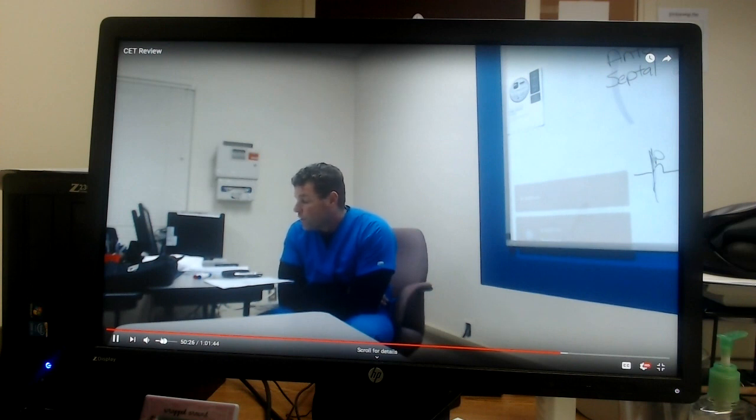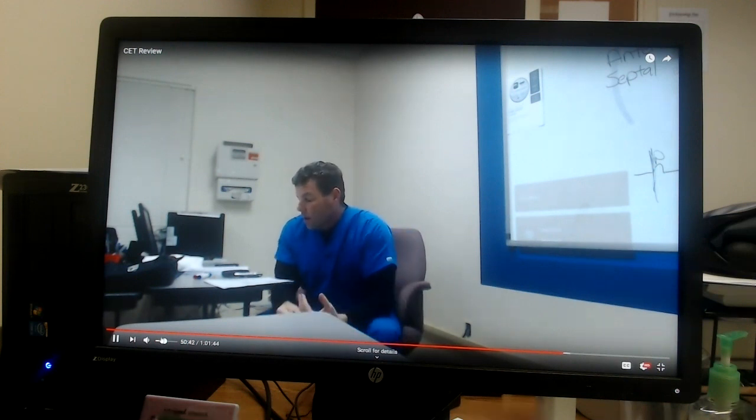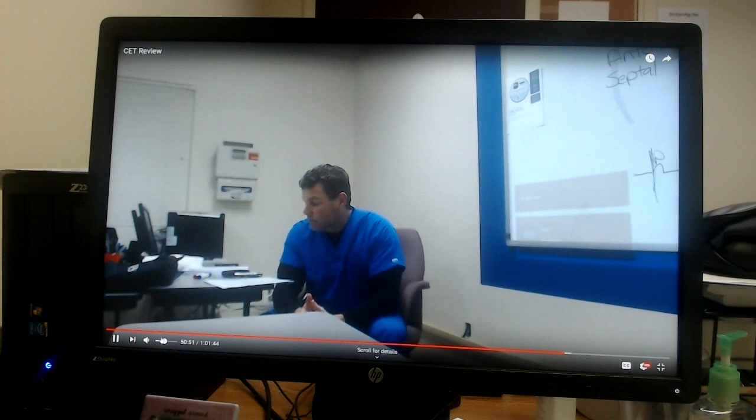97, the technician is verifying the calibration of the EKG machine. The technician knows that the standard calibration mark should be which of the following amplitudes? Number 5, 10, right, 10 small blocks or boxes. After performing a non-standard EKG on a patient, the gain setting should be returned to which of the following as the standard? B, right, 10 millimeters is the same as 10 small boxes. The question we had above.